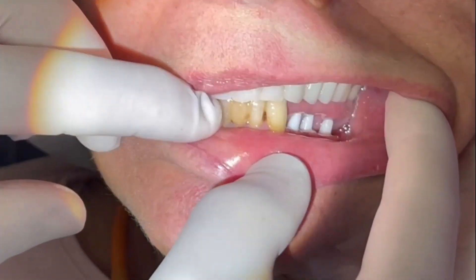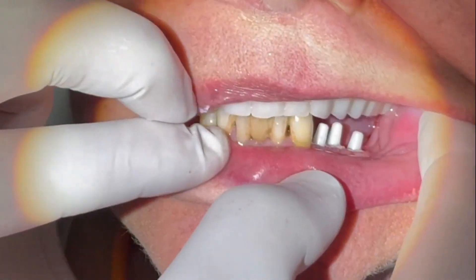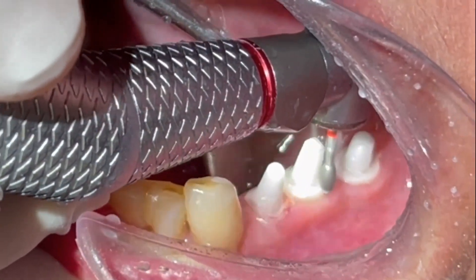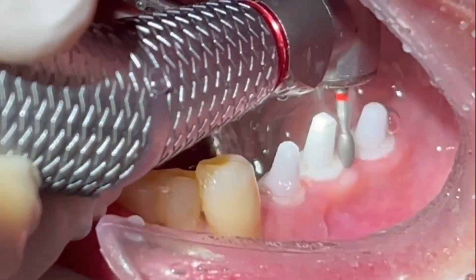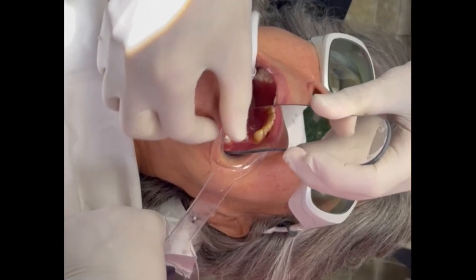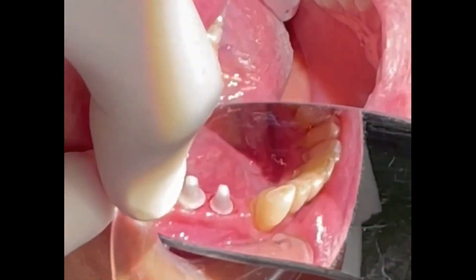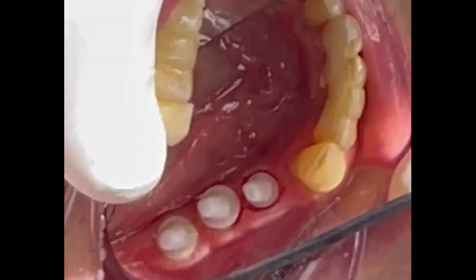Here we check the clearance, scan the abutments with the CEREC, and construct the crowns.